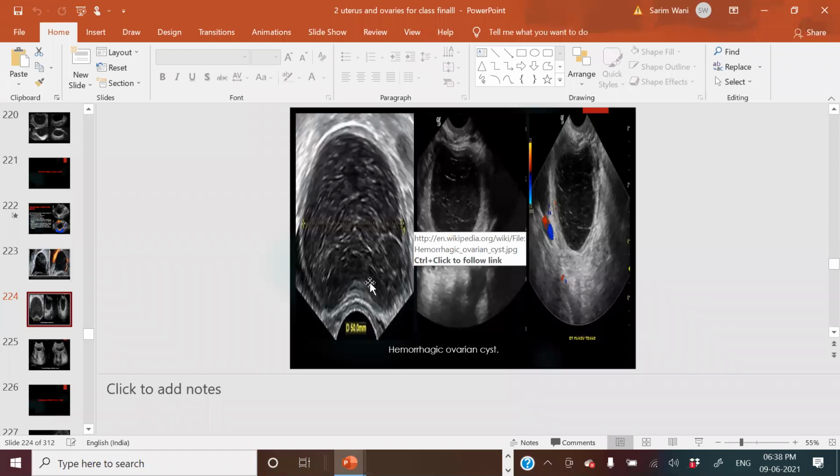Now, coming to the ultrasound picture, because we are discussing ultrasound. Will you expect any solid mass like hair or sebaceous glands in case of an endometriosis? Yes or no? No, sir. Note it down. Point number three. If you put a color box, we are just differentiating.